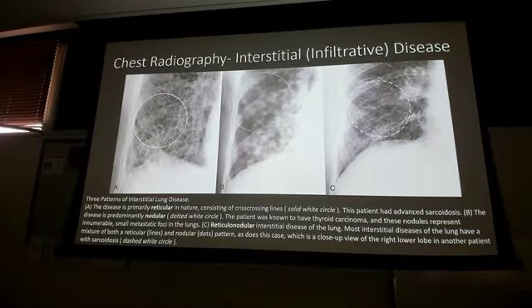What's up? So, speaking on the interstitial disease specifically. Between reticular and nodular, it's pretty evident with reticular and reticulonodular. It's very similar in both, sarcoidosis essentially. So I just want to know if there's a key difference between the two that is something to pay attention to if we're looking at X-ray. One has nodules, one doesn't.